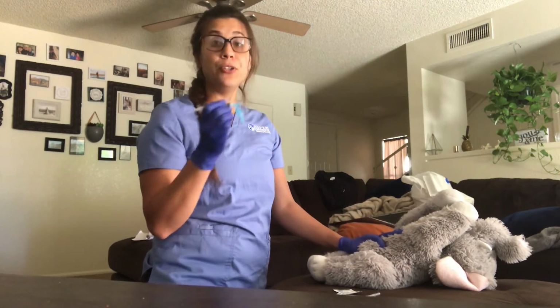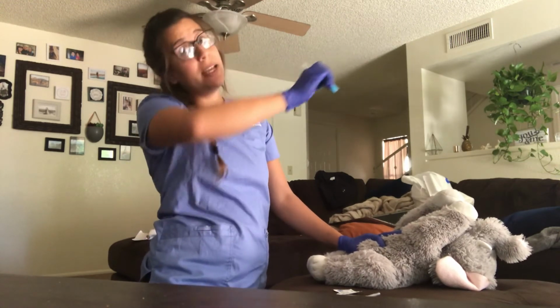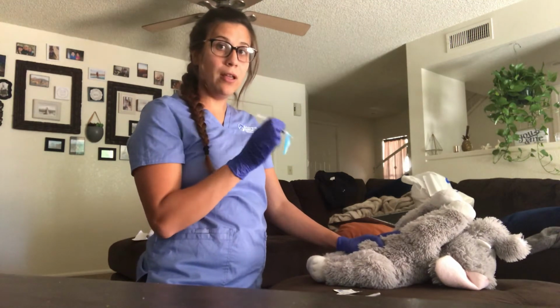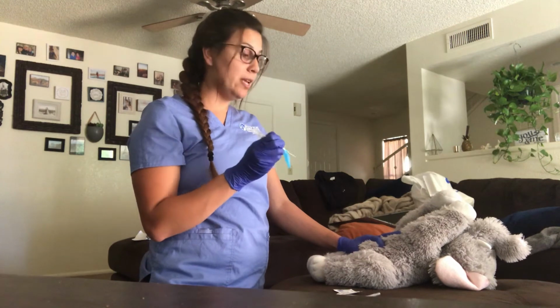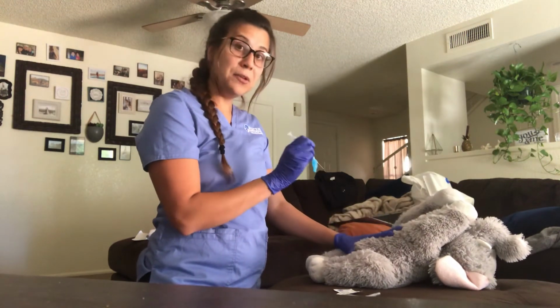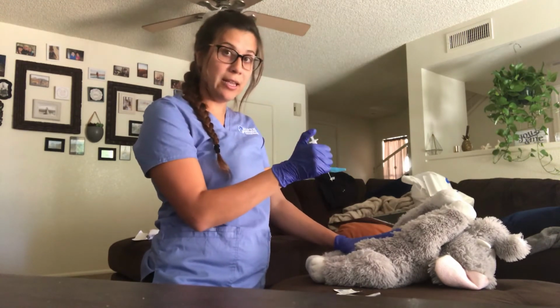If you were doing this with an injection pen, or if it was heparin, you would keep that fold while you inject the medicine. But for this normal injection, you would inject in, let go of the fold. You would keep your hand on the patient just for stabilization, and you would push the medication in slowly.